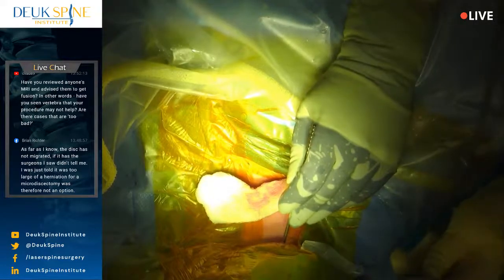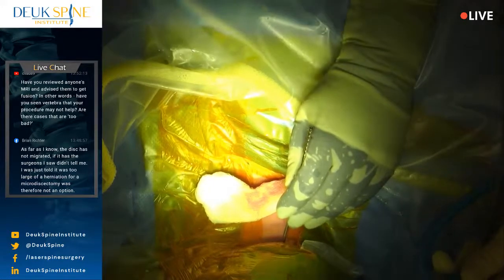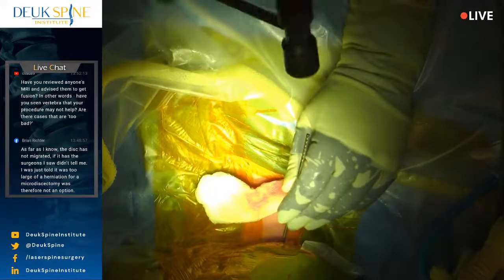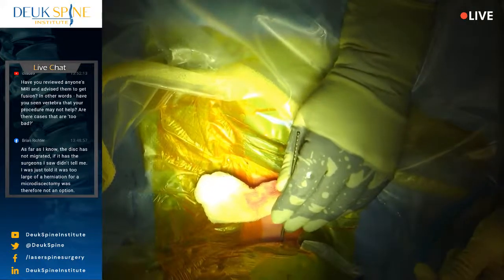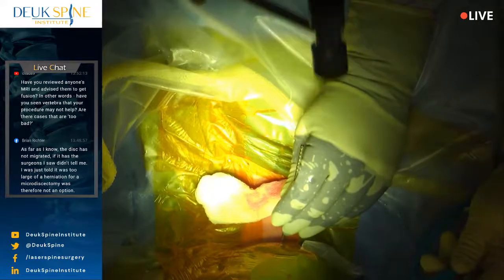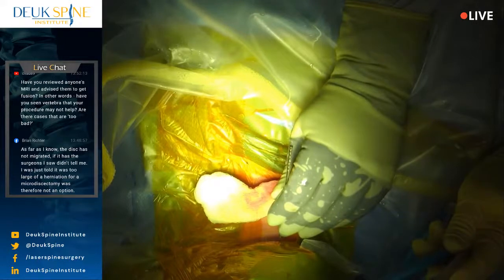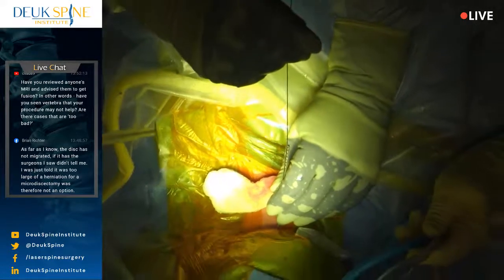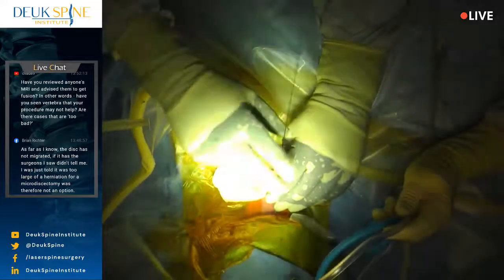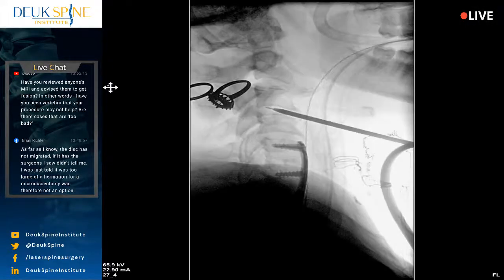Shot. I feel it going in. Nice. And I kind of let it go where it wants once it's in the disc. It follows the path of least resistance. Take. Pipe cleaner. We'll still do a discogram because I want to stain the herniated disc blue.